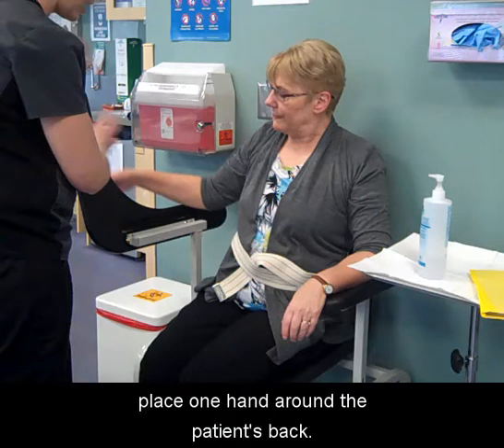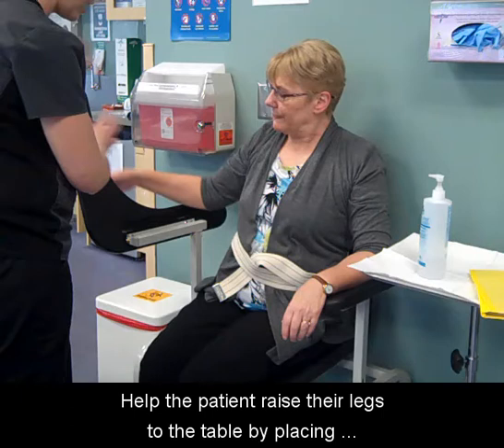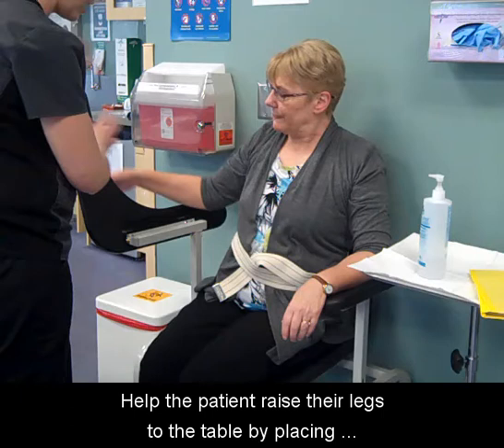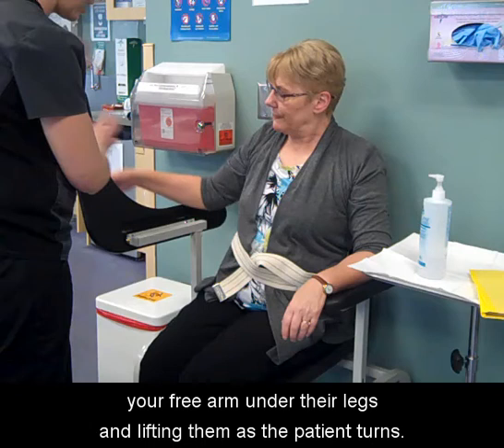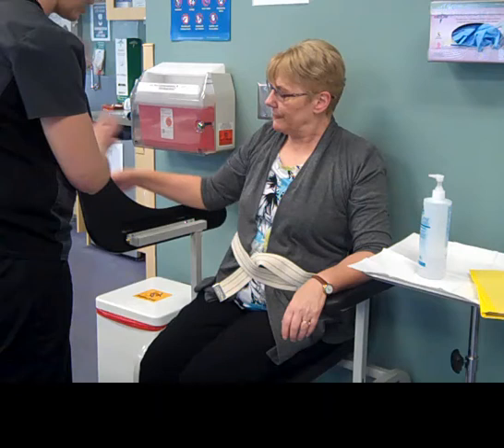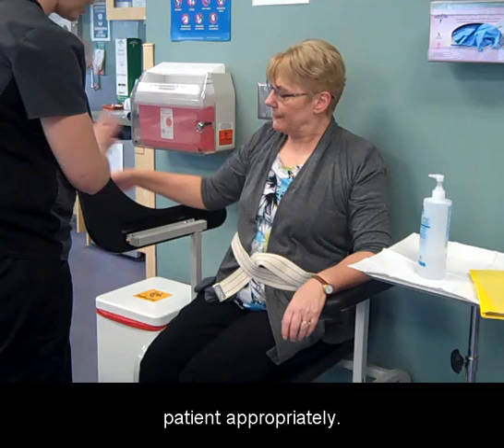If the patient needs assistance to lie down, place one hand around the patient's back. Help the patient raise their legs to the table by placing your free arm under their legs and lifting them as the patient turns. Place a pillow under the patient's head and drape the patient appropriately.